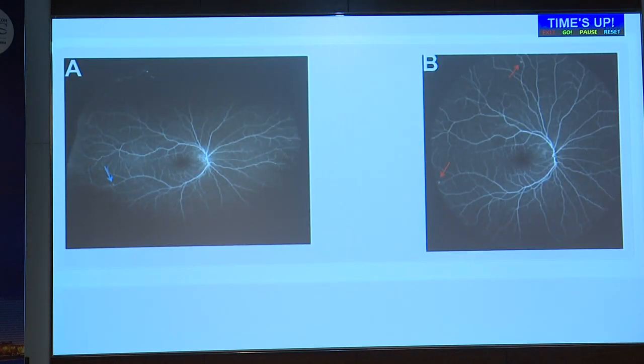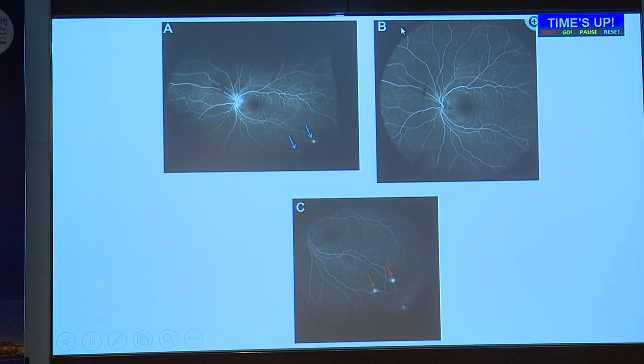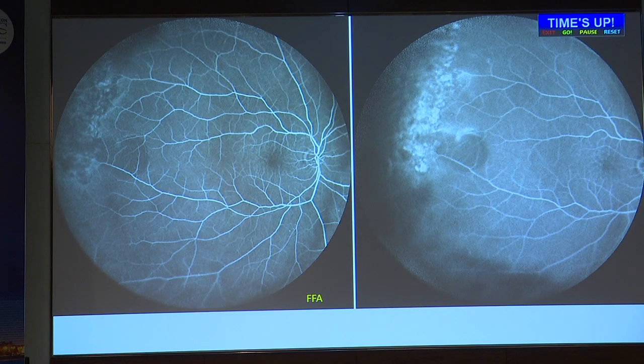So you can see here there are angiomas in the vertical meridian and the horizontal meridian both, and this can be picked up by both. But the peripheral lesion is not picked up by the single non-steered view of the OPTOS, but the Spectralis is able to reach the more peripheral areas in better resolution. So you can see this is the same PSCR patient with steered views.